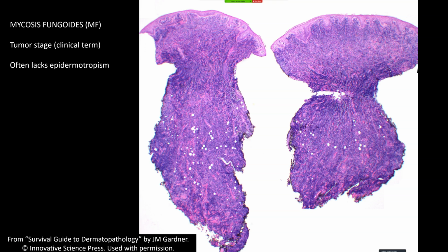Now, in those cases, I could not look at this biopsy here without any information. I can look at this and say this is almost certainly going to be a lymphoma or some other round blue cell thing, even from low power. That's abnormal. The dermis is completely wiped out with just a little bit of collagen left, and it's just filled with blue cells, right? Normally this kind of sheet-like filling goes very well for lymphoma, but I can't really go beyond that here because even from here I don't see much.